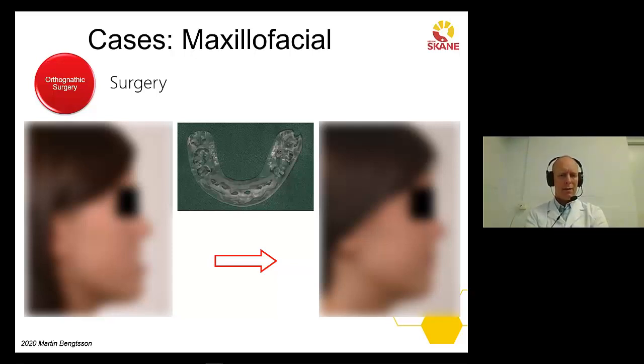As you can see, the patient is having quite an extensive change in the facial appearance, and all movements performed during surgery is depending on this little plastic surgical index. So it's very important that this device is functioning well with as close to 100% accuracy as possible.